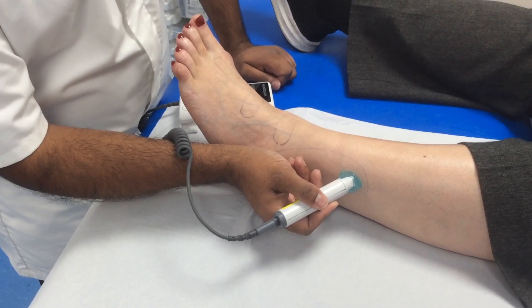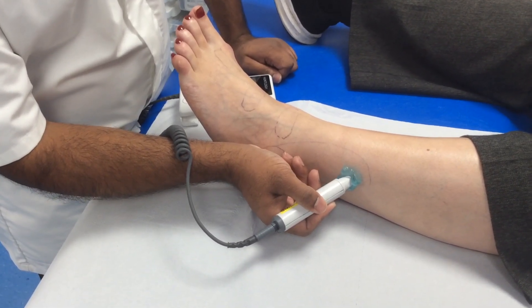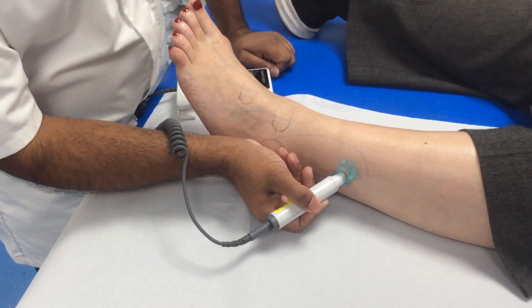Using a slow zigzag motion, search the area until you find an audible signal.